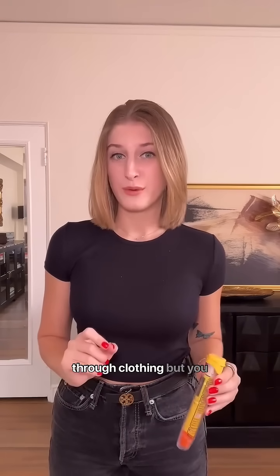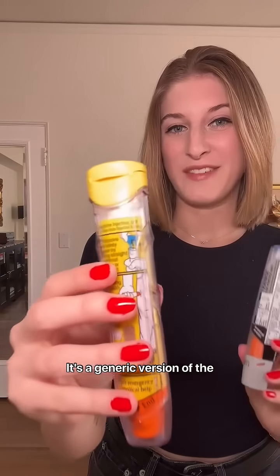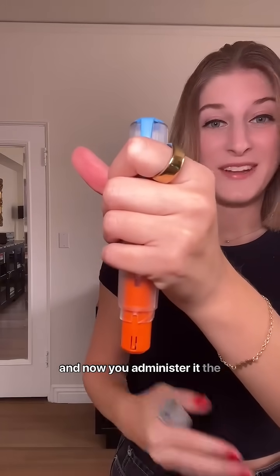The EpiPen can be injected through clothing, but you want to make sure you're not injecting it right on the seam, a button, or anything like that. This is the Teva — it's a generic version of the EpiPen. Instead of coming in a case like the EpiPen, you twist the bottom and then administer it the same way.